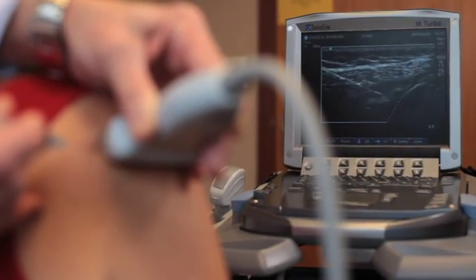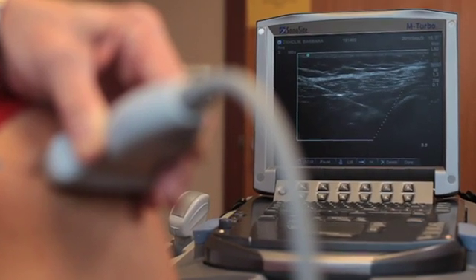To have everything in one package is very helpful. To not have to turn on or set up any additional equipment is important. To increase your accuracy and your ability to get to joints that you normally wouldn't be able to aspirate or inject also increases your potential business.